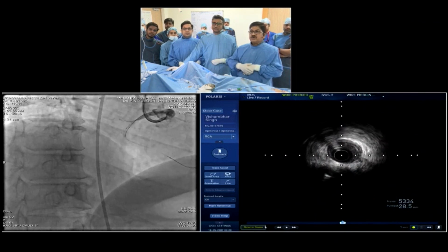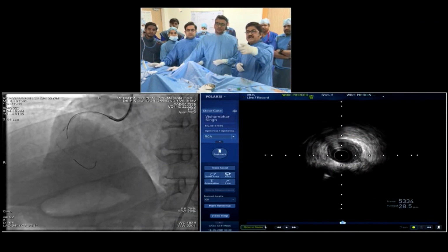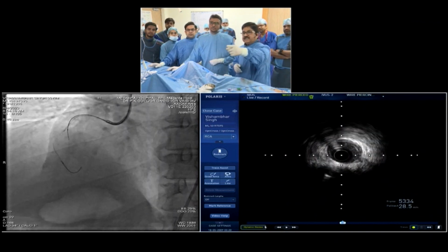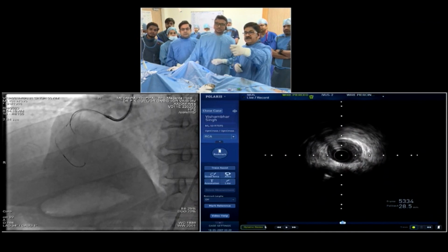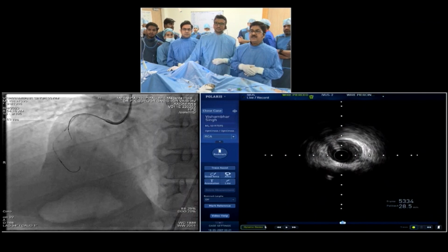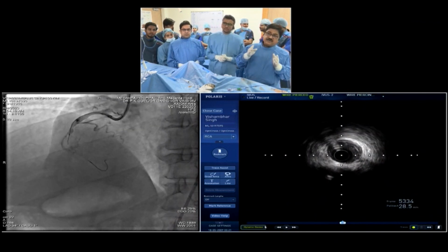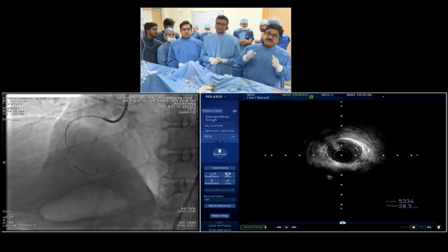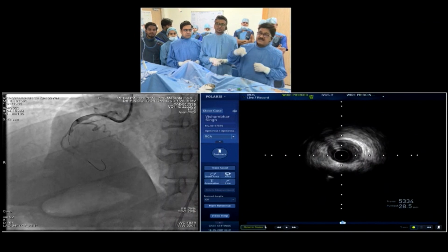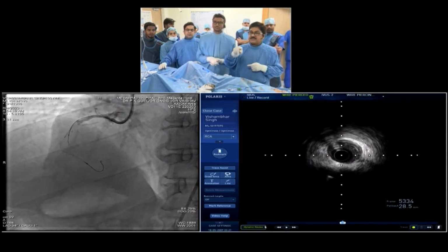After entering, at this stage, you see that there is an independent movement of the tip. It is not correct. You are seeing the distal vessel there, but this is not right. So pull it back a bit. With that movement, I don't want to proceed further. I did not want to proceed further and create big subintimal spaces and hematomas, because as I told you, my last strategy in this case is ADR, if I don't succeed here.